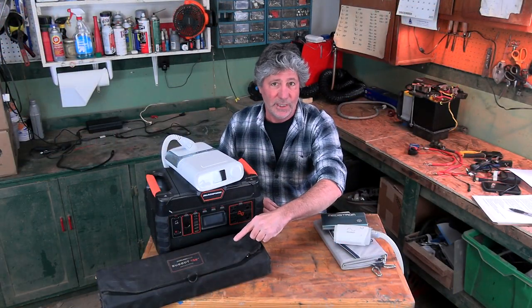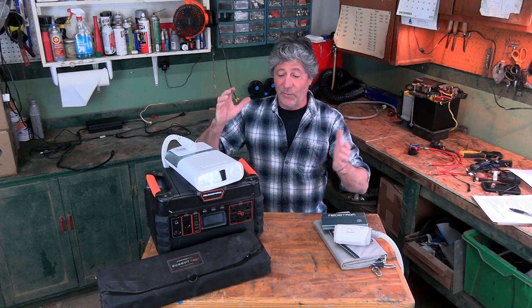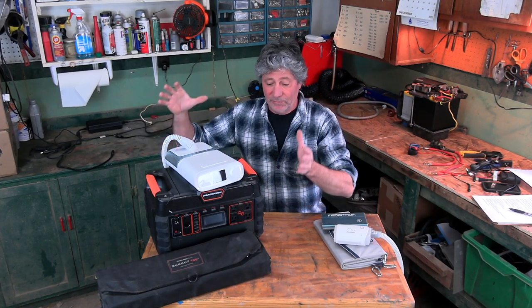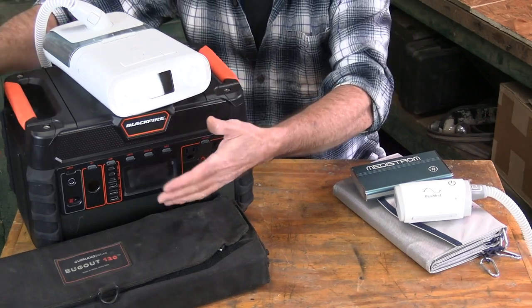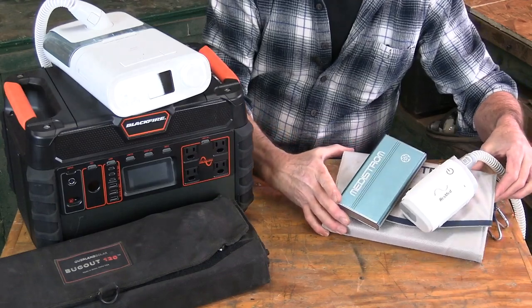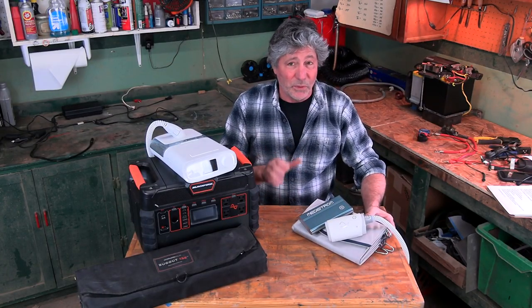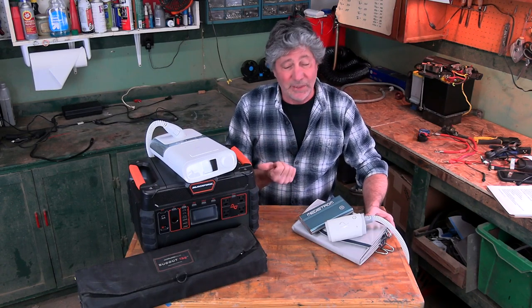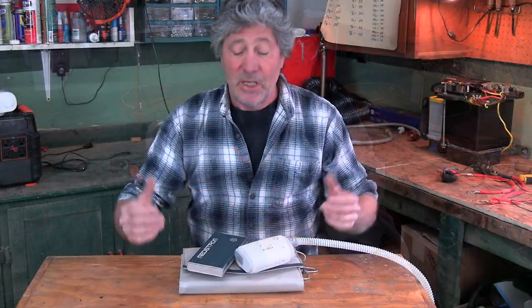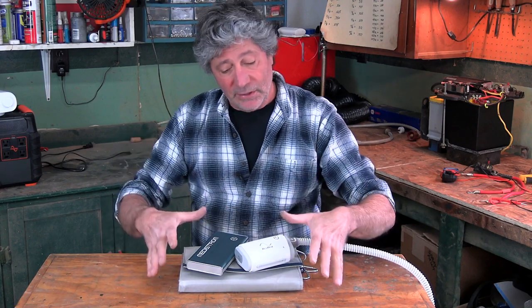This is the solar panel I use to recharge the large unit. So I went from this big, bulky, heavy system to this right here — a fraction of the bulk and weight, and it works every bit as good as my old system. Am I happy with it? Absolutely. Would I recommend it? Definitely yes. I put a link to it in the video description.